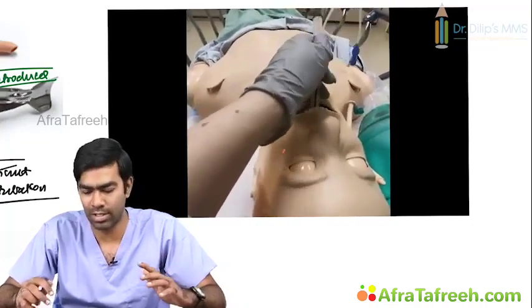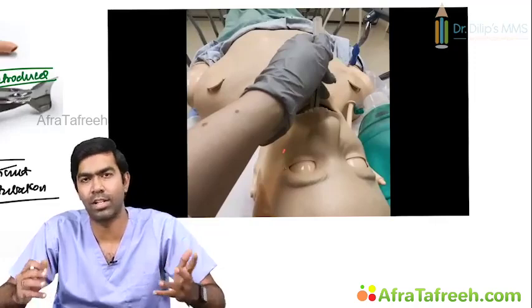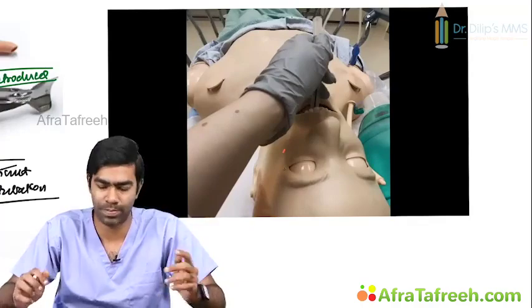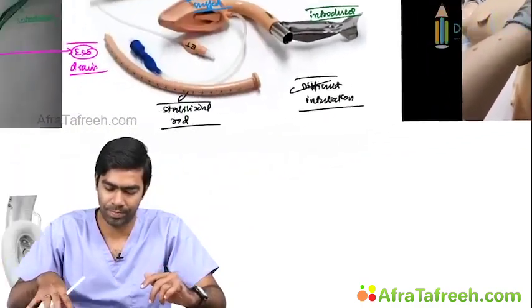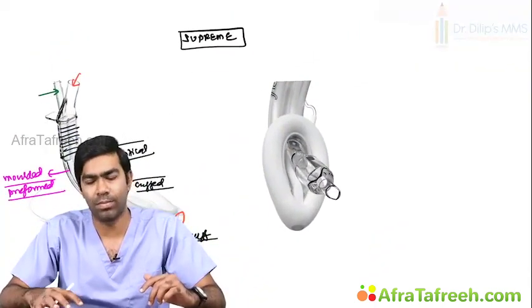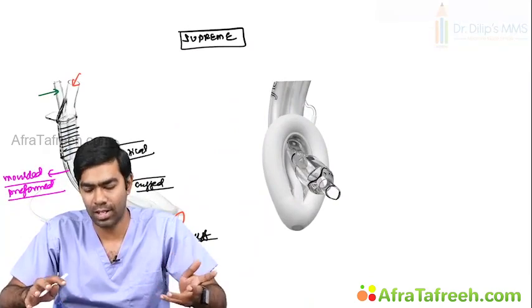This intubating LMA is especially designed for aiding difficult intubations. So that's why this is a special device, fast track LMA. Clear? So now we have discussed LMA Supreme, LMA fast track and a ProSeal LMA also.